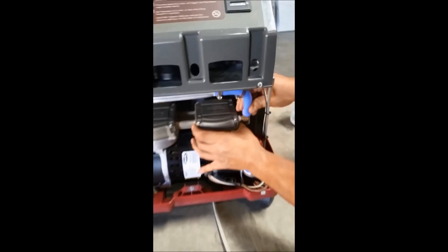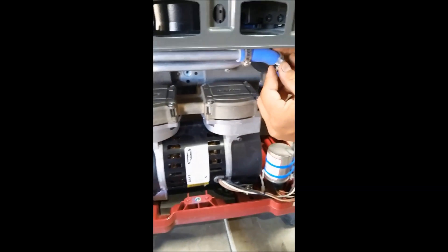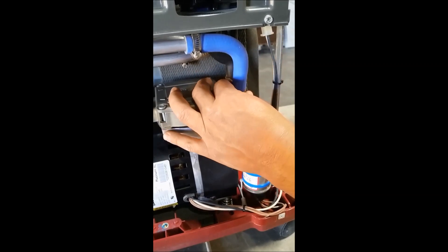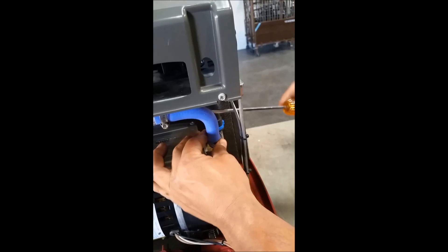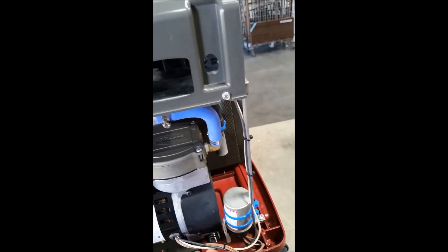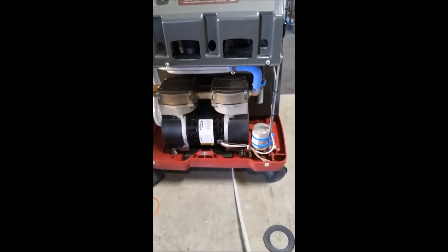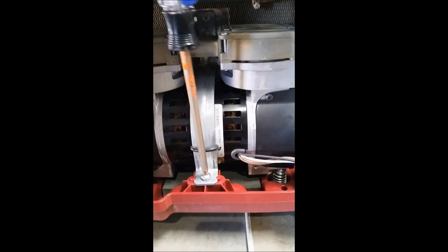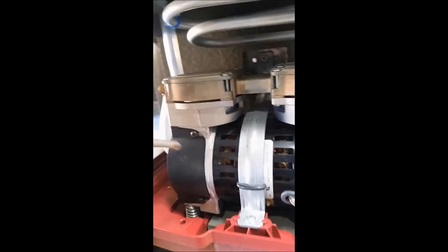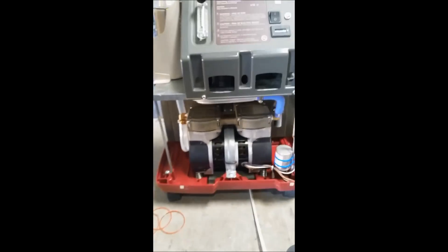Next you'll reconnect all the hoses from where you first took them off. Slide your hose gripper down and re-tighten it with the screwdriver. Put your wires back into the gripper. Now your compressor has been basically put back together. We need to return the large bar that we initially took off that holds it in place — screw it back in here and all the way up here, and now it's fully restored.